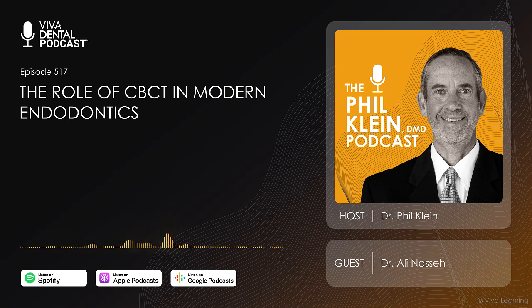And endodontics really became possible as a result, originally, of just radiography with regular X-ray imaging that gave us an insight, without having the tooth extracted, of what kind of anatomy and the number of canals and teeth that we were working with before we could access the tooth and treat it, the length of the canals and so on. But obviously, the original radiography was two-dimensional and it was compressed, so we were only getting information by looking at the shadow of the tooth in a two-dimensional way.